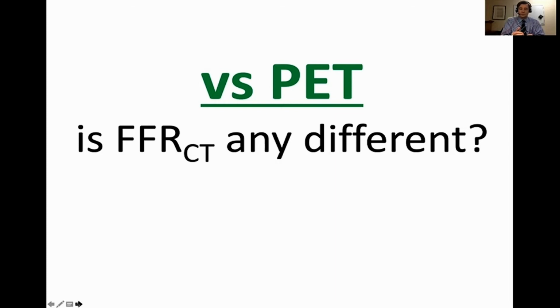There is this issue of it reducing the number of invasive angiograms, but it makes up for it in cost anyway by ordering all these other tests. And I think it was largely interpreted by people as a neutral result. It's not that FFRCT added any advantages there.